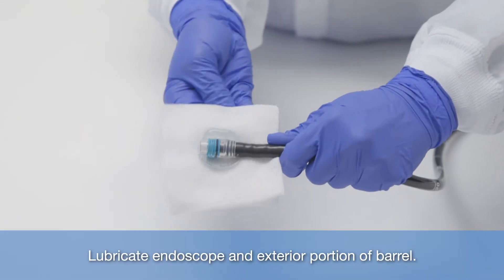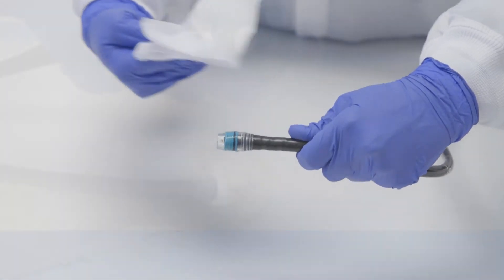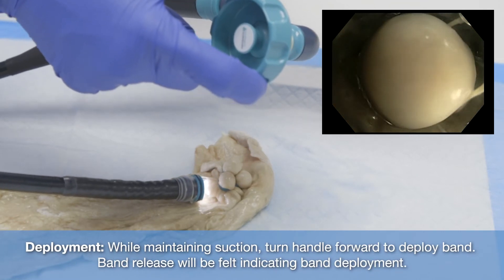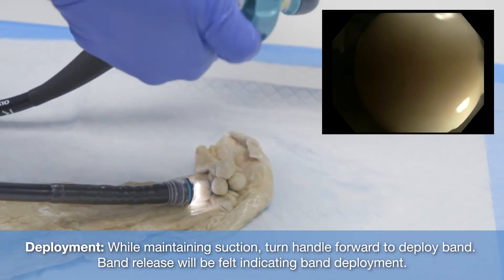Lubricate endoscope and exterior portion of barrel. During deployment, while maintaining suction, turn handle forward to deploy band. Band release will be felt indicating band deployment.